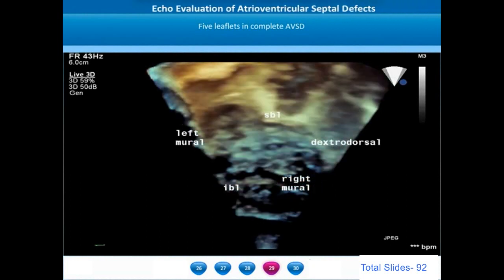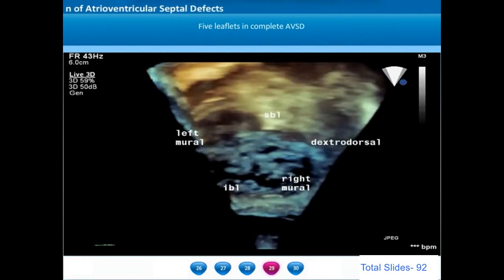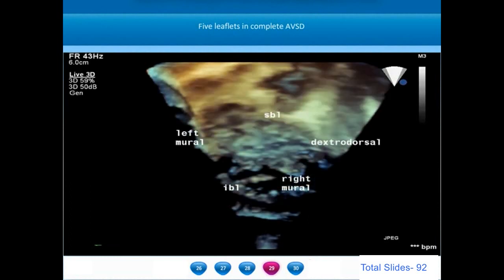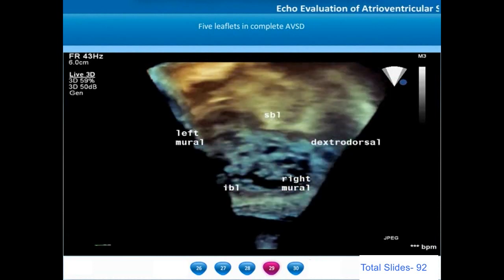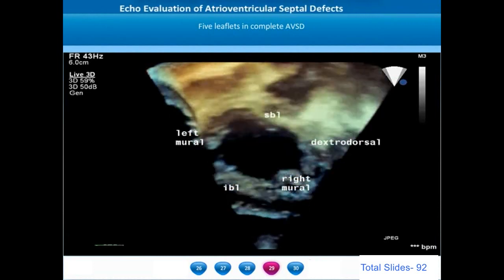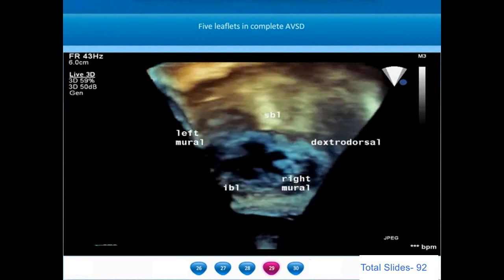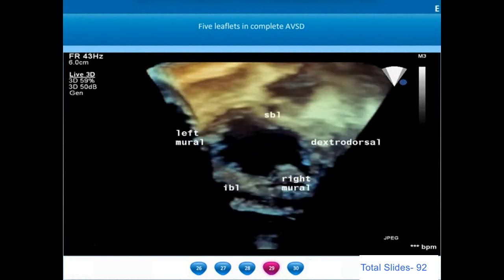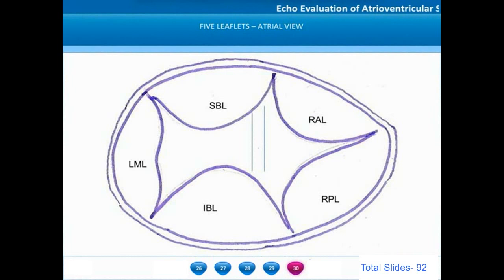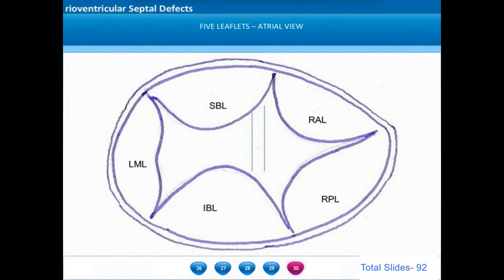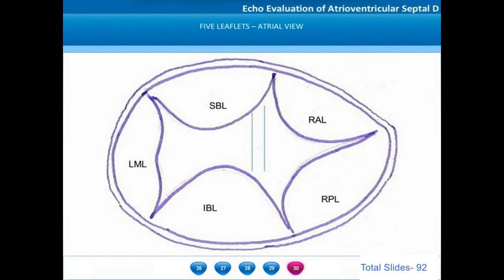The atrial surgeon's view on three-dimensional echocardiogram shows five leaflets in a complete AV septal defect. The superior and inferior bridging leaflets are named superiorly and inferiorly. The left mural leaflet is on the left side. The dextrodorsal leaflet is the other name for the right anterior leaflet, and the right mural leaflet is the other name for the right posterior leaflet. The crest of the ventricular septal defect overlies the commissures between the bridging leaflets and right-sided leaflets.